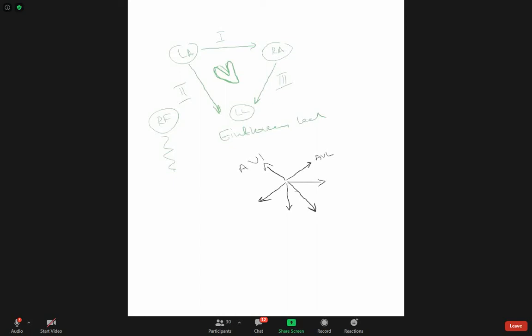Okay. So this is how they created the limb leads. فعندنا 4 electrodes that attach your body. بعدين منها طلعنا limb leads. طلعنا كم limb lead؟ عندنا 6 limb leads.